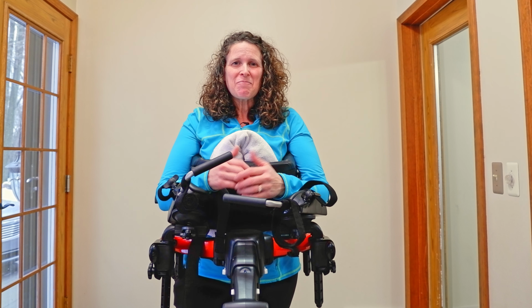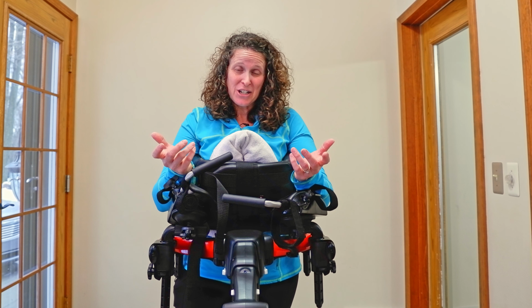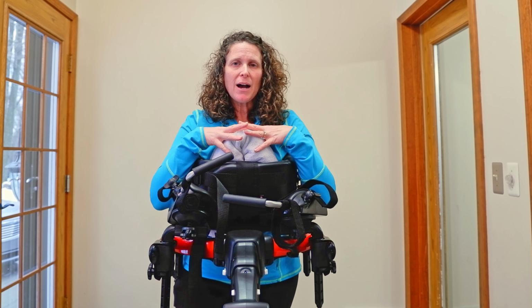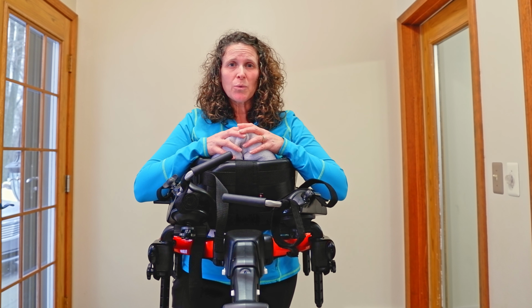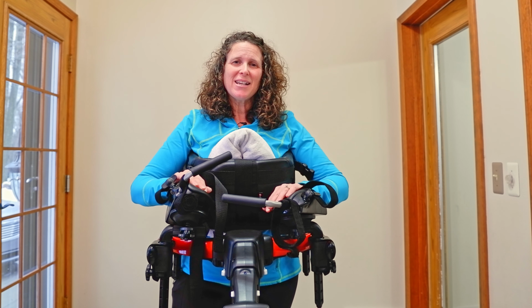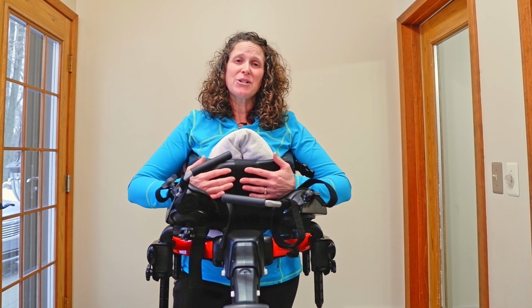I hope this helps you in finding some other solutions of making adjustments on your pacer. There are so many different ways that you can adjust your pacer. I would really suggest that you get in the pacer, you kind of position yourself like the individual you're trying to position, and just play around with adjustments to your chest, adjustments to your arms, adding towel rolls laterally if you need to. There's so many different ways that you can adjust the pacer, and if you know how it feels, it makes it a lot easier to adjust it when you're working with your individual.